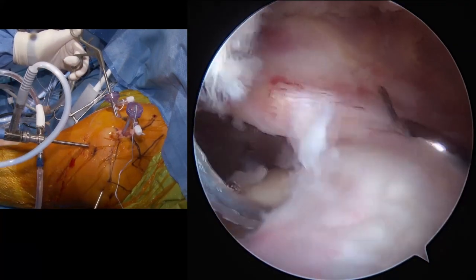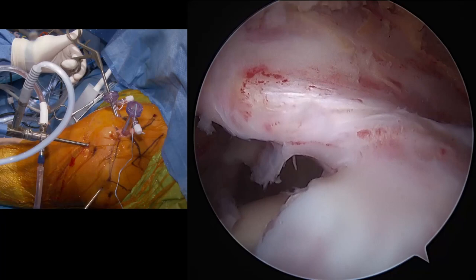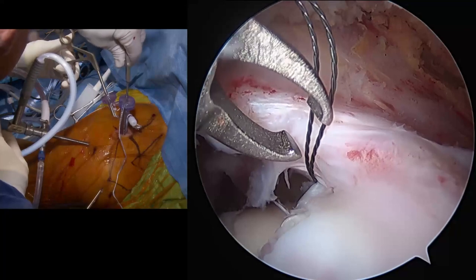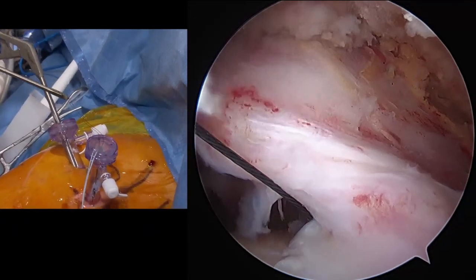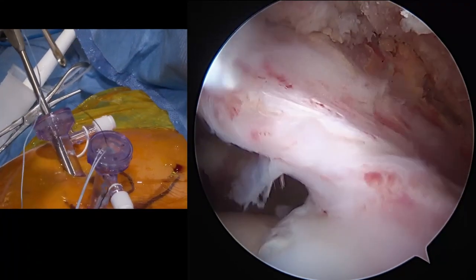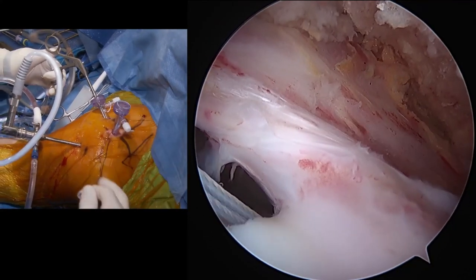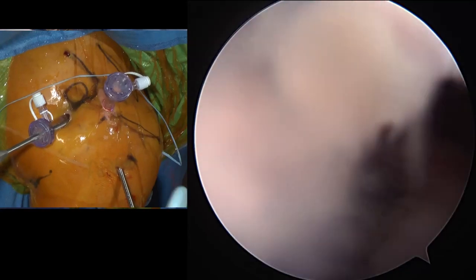And we'll take the crab claw in just a minute. We're going to come back here to get this tissue to move forward. Crab claw. And we'll pass this. Hold the scope for me, just reach up and support it. We've got our tape that we can pass through here. Okay, take that. Okay, so that'll be our first one. Take that back. Okay, and you can let go of that.